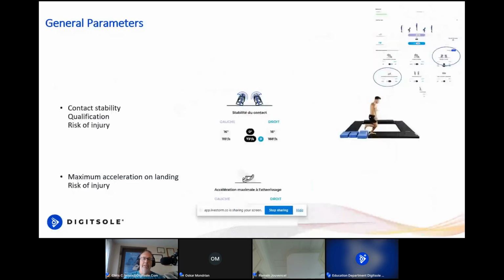The contact stability, this is a very interesting one. So those clinicians that are familiar with Romberg's quotient or Romberg's assessment, which is the rapid deviation from a center position. So the contact stability, what we're able to capture is on strike, we're looking at within the first 200 milliseconds, the amount of deviation into that pronosupination position, as well as how rapid that takes place.